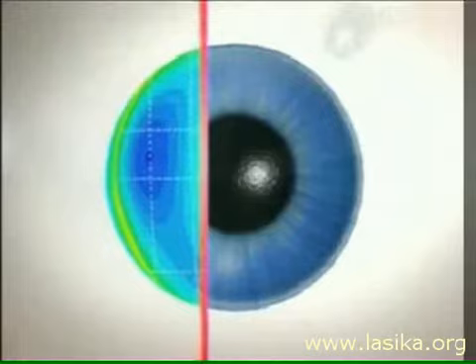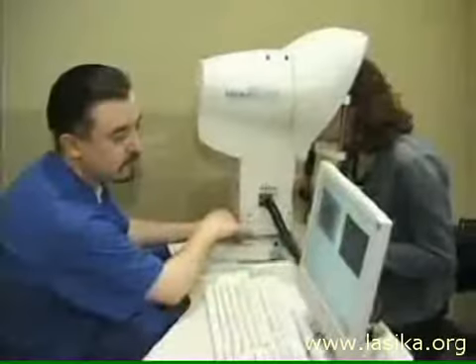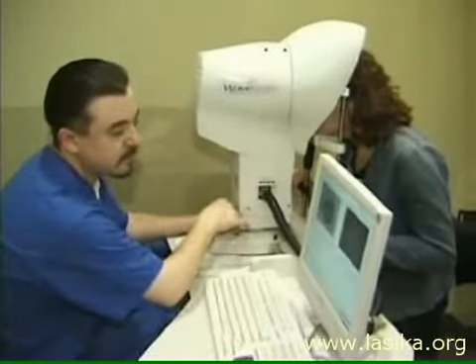Custom is based on a wave scan of your cornea, and this is kind of like taking a fingerprint of your eye and applying this to your cornea. An analogy for custom technology is the following. If you take 50 people that wear the same size 10 shoe, and you take that shoe off and look at their feet, you're looking at 50 different feet.